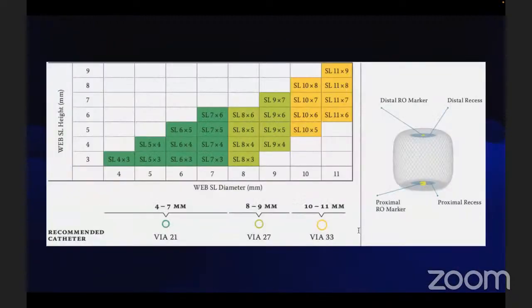And when it comes to the WEB, I just wanted to go through the WEB also, because I told why we have not used it: if it is a slender one or a spherical one, we can use it. The minimum criterion for WEB is that the aneurysm should be more than 2 in size. In both devices, there should not be any thrombus inside. Yes, sir, after clearance only we have to keep it. That is where initially we could not place it. That is the first requisite.